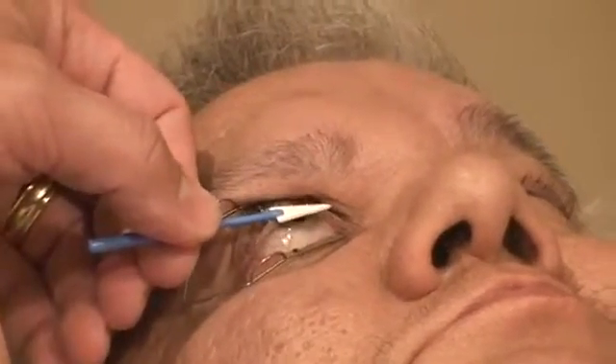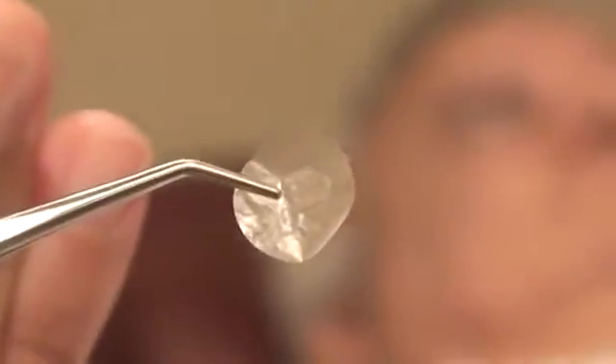Try and open both eyes. There you go. I don't know if you can see on that. Does that come into focus — the O and the P? Let me back it off here. I'm going to find you on my lens. There it is. Yeah, I can see it there. And so that's the part that just goes down — the cornea. Open both eyes.